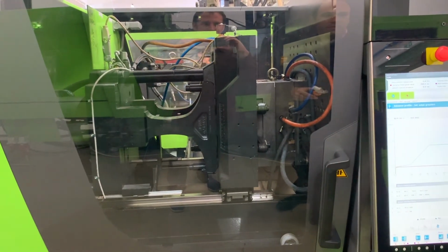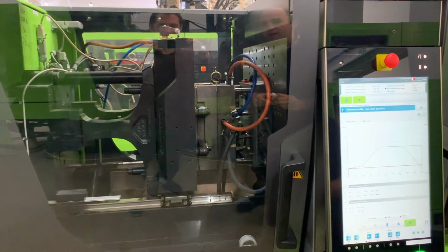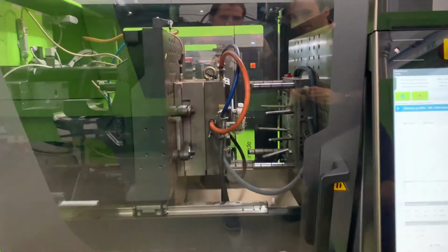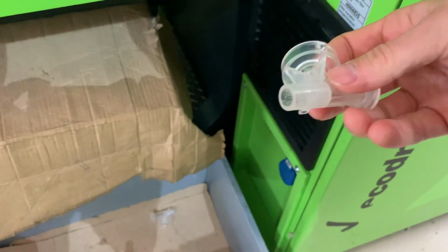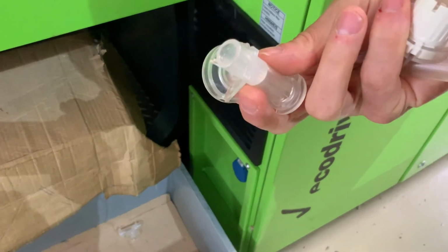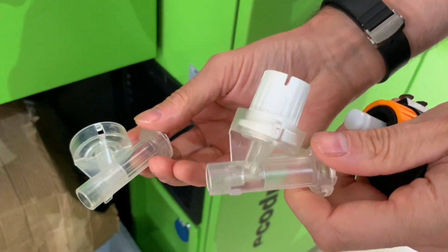I think we've got about a 50-second cycle time on this. 48 seconds, parts opening, the ejector pins spitting the parts out. They come out a little bit cloudy, and then as the plastic cools, they end up clearer. So this one we've had out for quite a while.